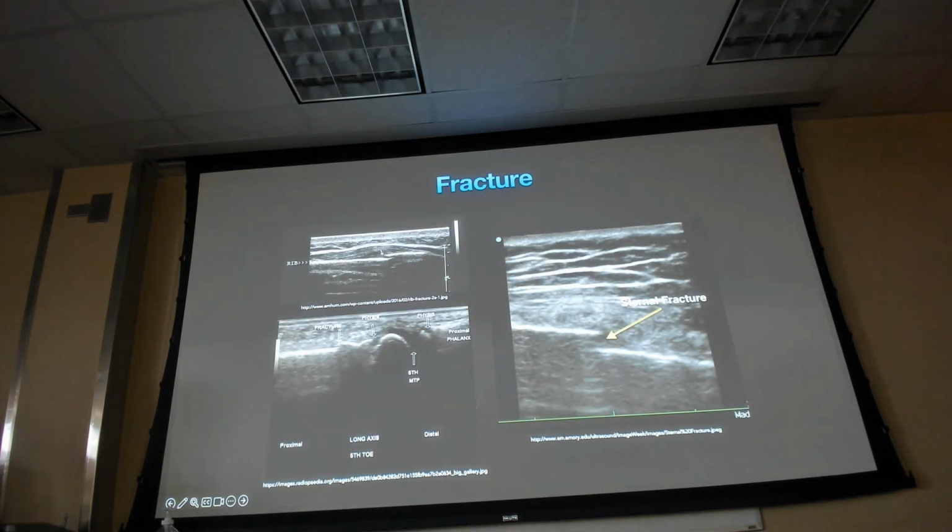But we can easily do a bedside ultrasound and just follow the bone line, and look for any disruption. Like this is a rib right here, you can see bone, which is hyperechoic white, and then a clear disruption, right? It's so simple to do, and they're so superficial that you can nail this diagnosis all the time. Same here, this is a fifth toe, so we got a fracture right before the fifth MTP. So here's the joint, and then we have a disruption of bone here.